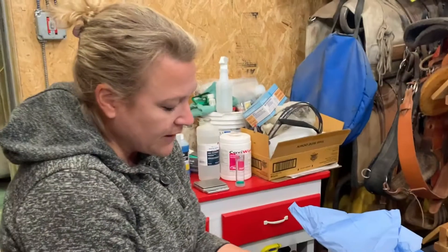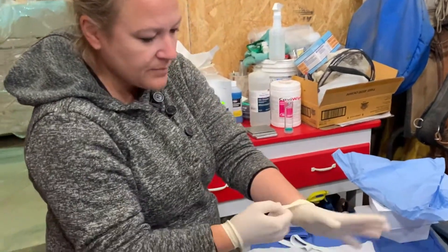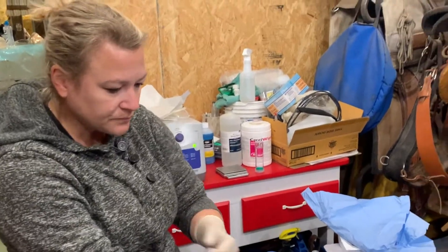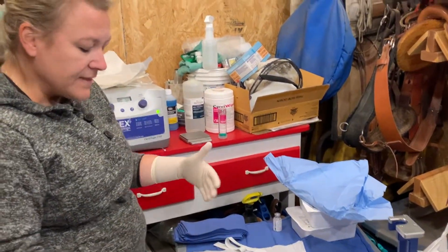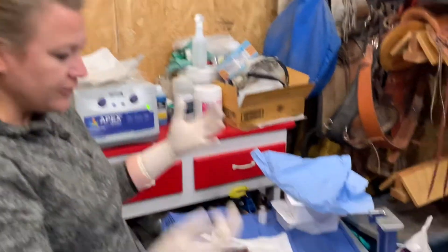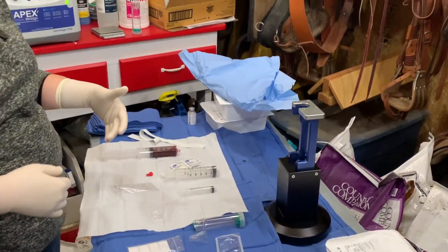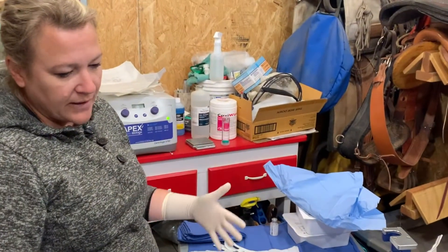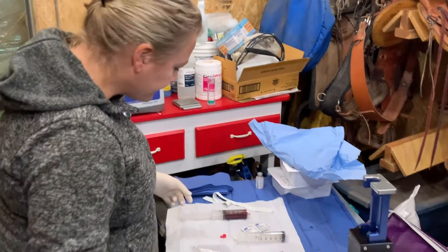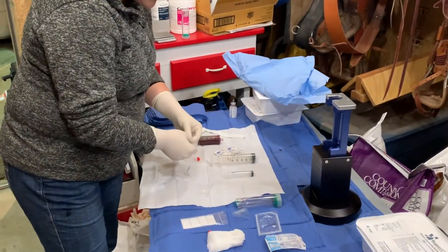After I collected the blood, I went ahead and put a new sterile pair of gloves on because this hand did touch the horse's neck to hold the vein off. This will be for my prepping, and then I will scrub the horse with a sterile scrub for the stifle. Then I'll put a new pair of gloves on for injection — I want to eliminate as much debris as possible to prevent joint infections. That's why I go through quite a few gloves.